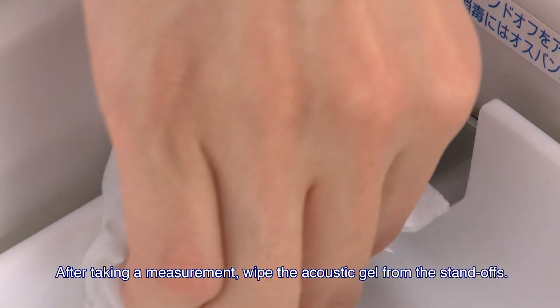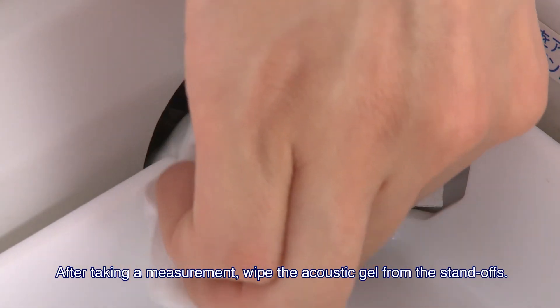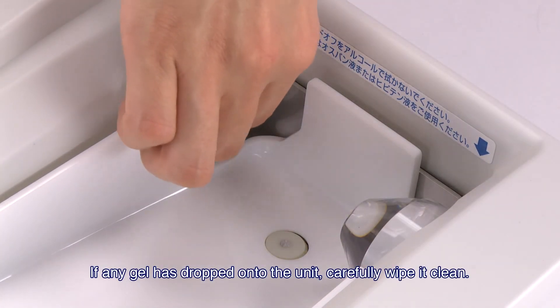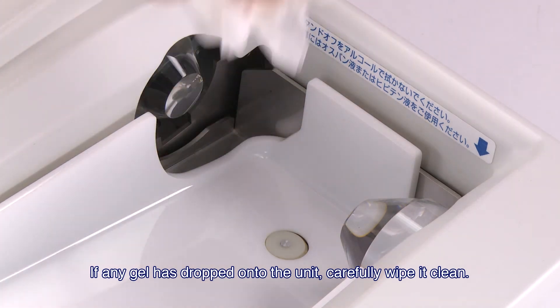After taking a measurement, wipe the acoustic gel from the standoffs. If any gel has dropped onto the unit, carefully wipe it clean.